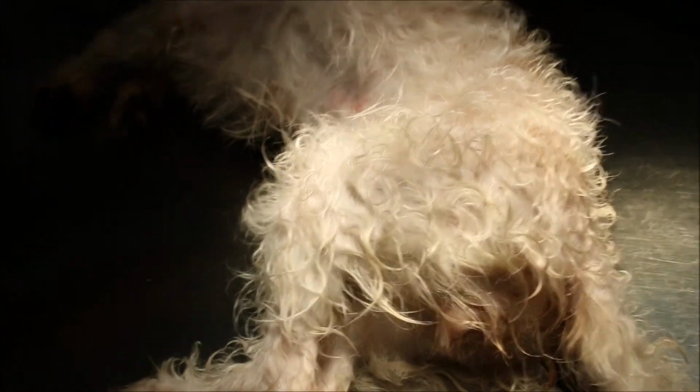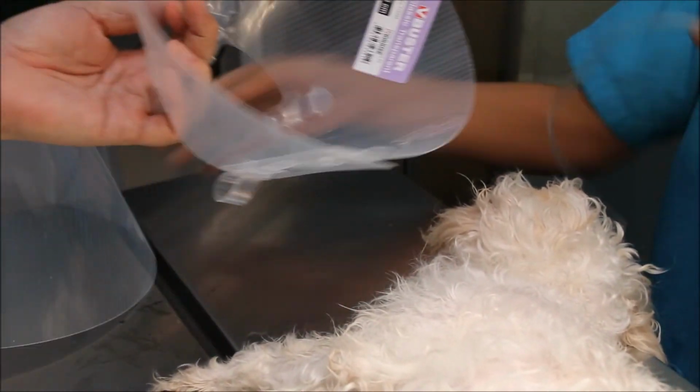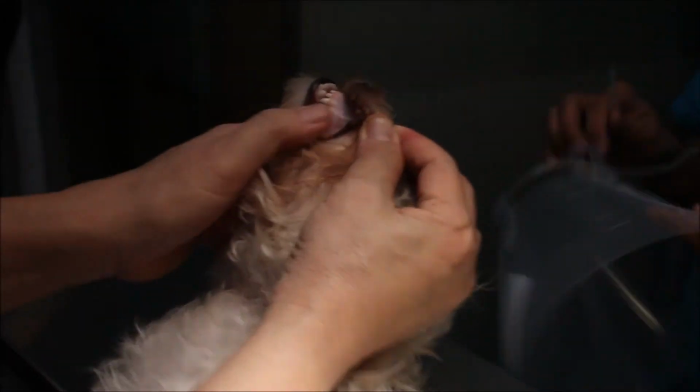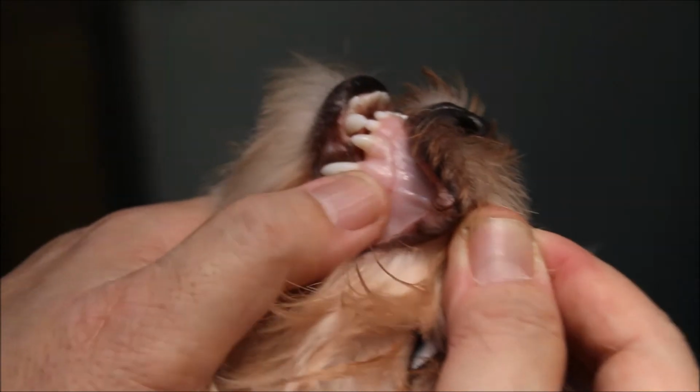Okay, so it's 5:42. Now this e-collar may be too big. What size is this? 15. Normally size 14 or size 12. This is more like for a cat. The gums are okay, a bit pale. Normally under anesthetic they do have pale gums, but the tongue is okay. You can see the color.